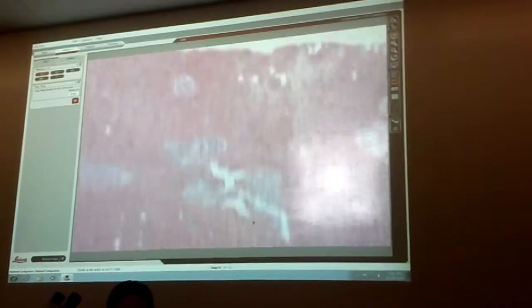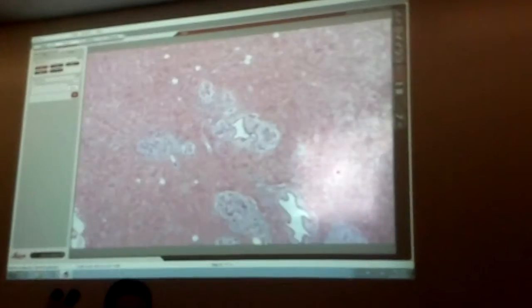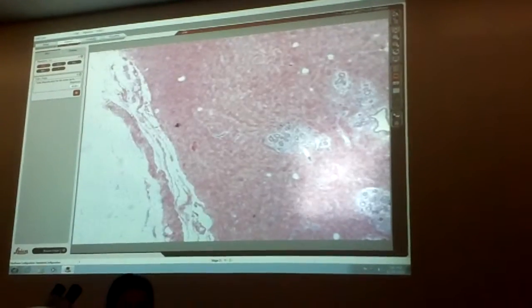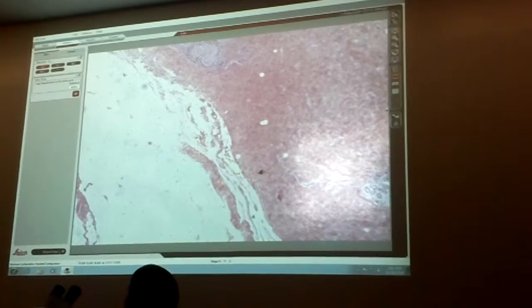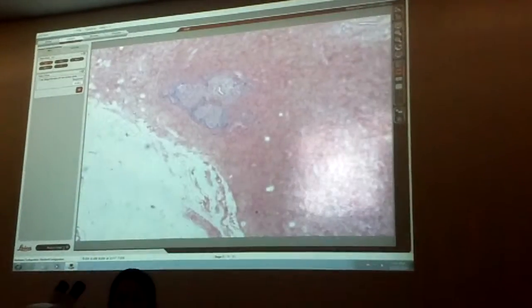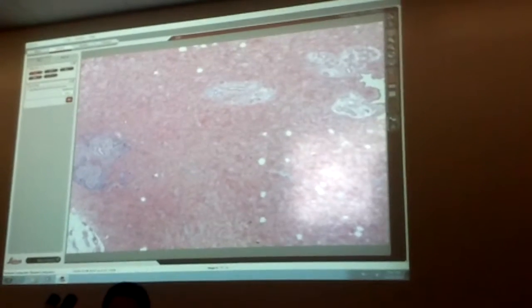So we can see. I saw some right at the edge. It was a huge amount. There. Let's see if we can find some better. Look at all those lactiferous ducts. Yeah, all that's adipose. Like that. Notice how much, again, interlobular connective tissue there is. There's a lot. All over. So again, lactiferous duct, lobule, each one of these glandular alveoli.